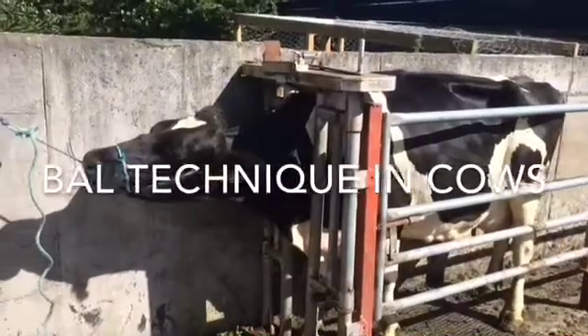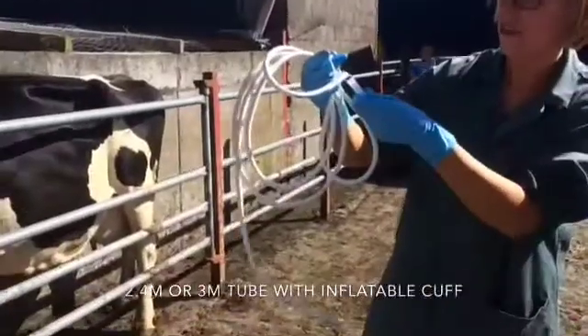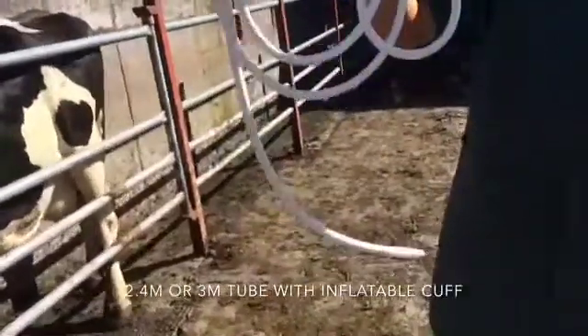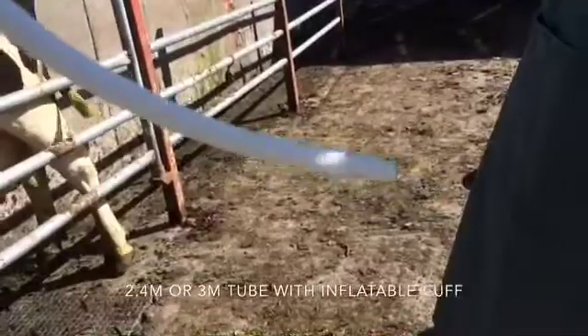BAL technique in adult cows. A 2.4 or 3 meter BAL tube with an inflatable cuff is required. These can be obtained from Duggins in Holy Cross, County Tipperary.